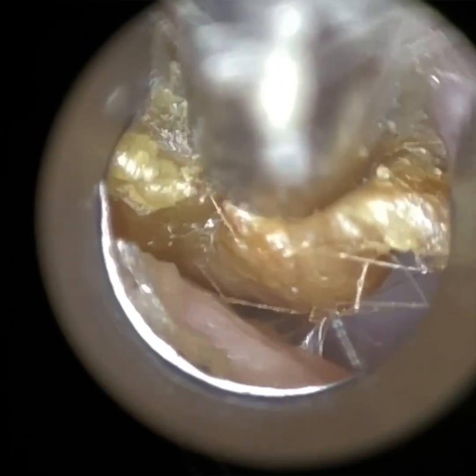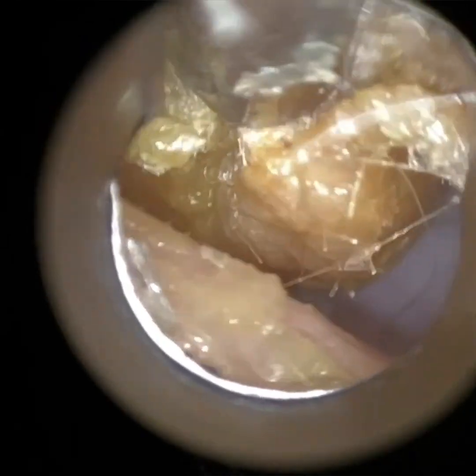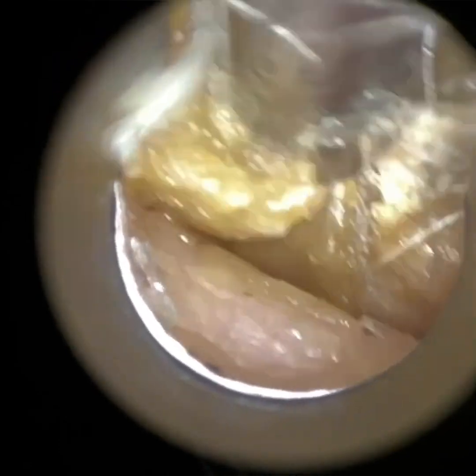The reason why this procedure is quite complex is because the patient's ear anatomy is extremely narrow, twisty and bendy. There's also quite a steep inclination of the ear canal. Most adult ear canals have an upwards trajectory of around 32 degrees as you enter, but I would say this patient's is a bit more than that. In addition, the consistency of this wax and keratin plug is extremely occluding and impacted, and there are quite a few skin adhesions enveloping it that are still partly attached to the canal wall — it's almost as though I'm playing tug of war with the ear canal to extract this plug.